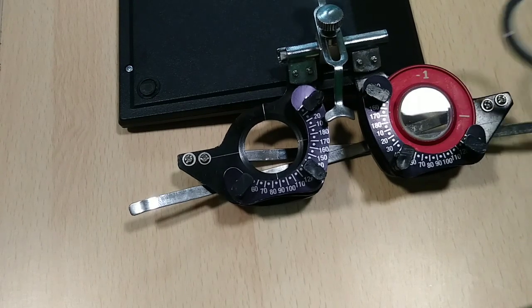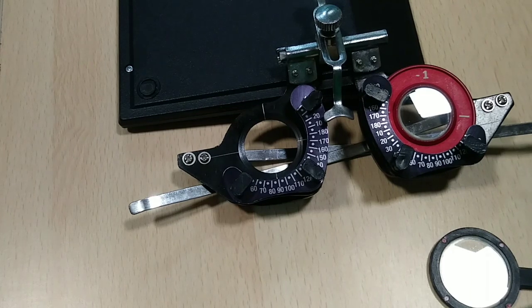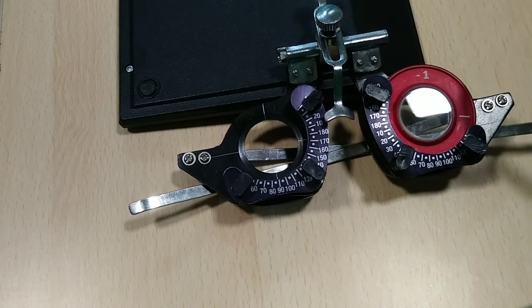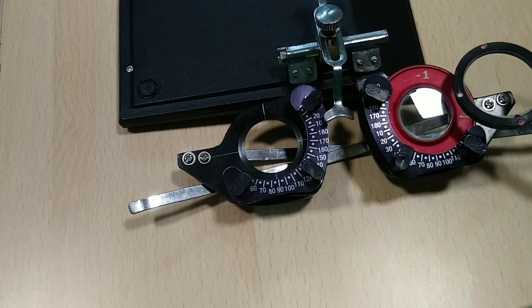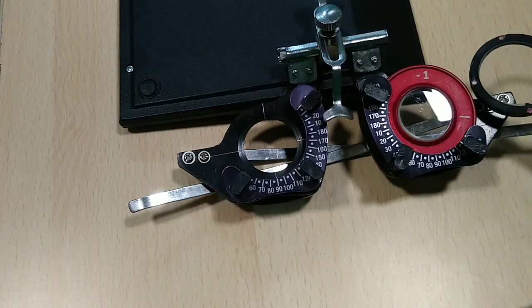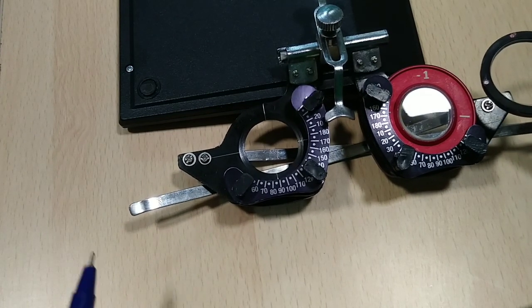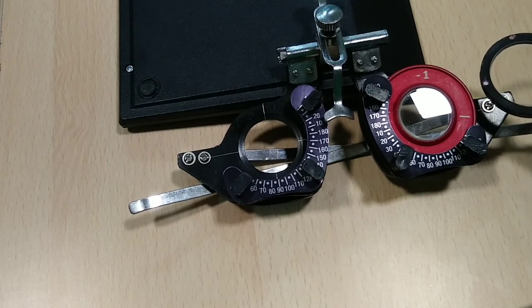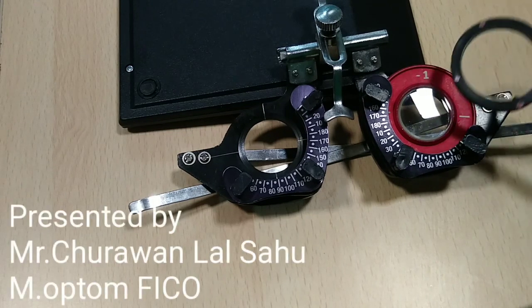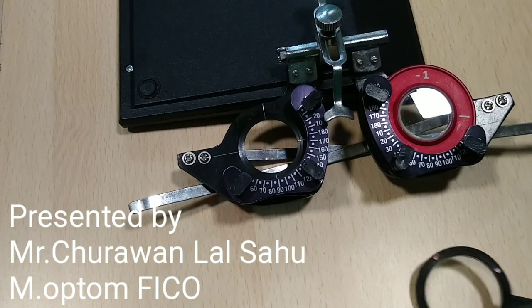Once the patient confirms both positions look equal, remove the JCC and check the 6/6 line to confirm the patient's vision. If you have increased cylinder power by more than 0.5 D — for example, from 1.0 to 1.5 — you must reduce the spherical power accordingly: if minus 1.0, go to 0.75; if plus 1.0, go to 1.25. Finally, perform subjective refraction again at that particular axis and cylinder to adjust the spherical power properly.